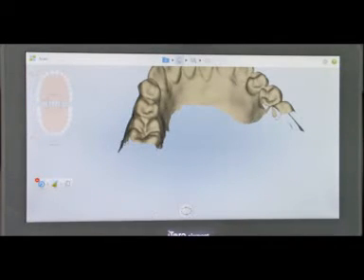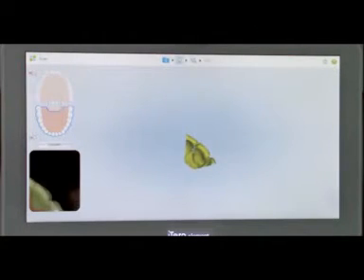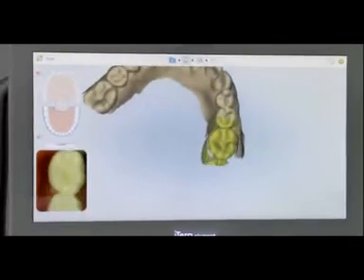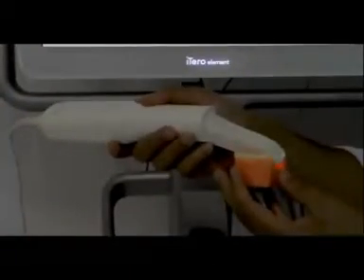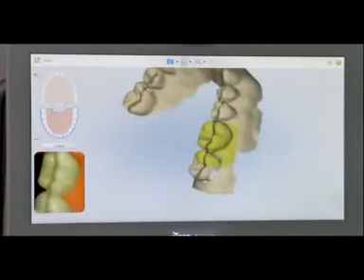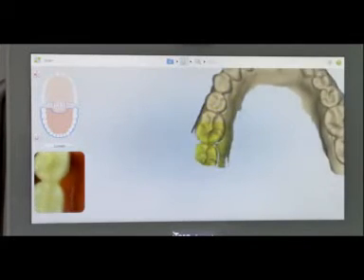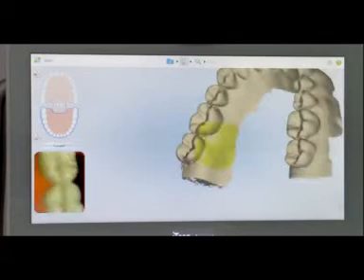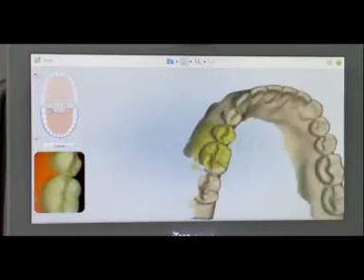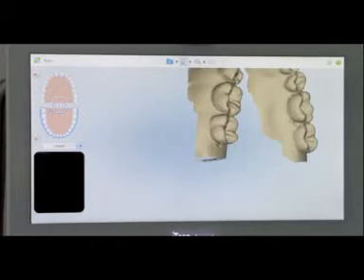And then I press scan, and then I start on a place where I've scanned before, and it will jump in, and then you just continue along like that. Again, go to the other side, and we just fill that in, okay? Alright. Okay, any questions so far?